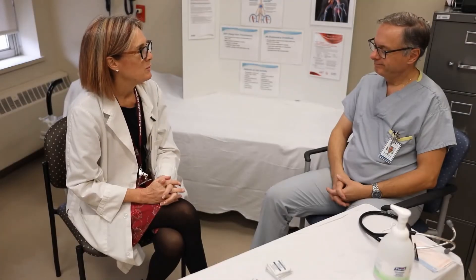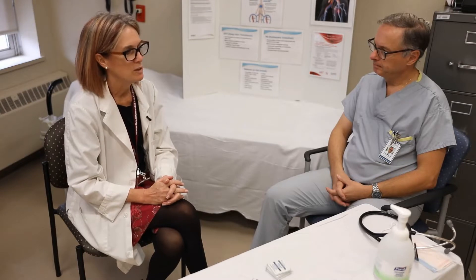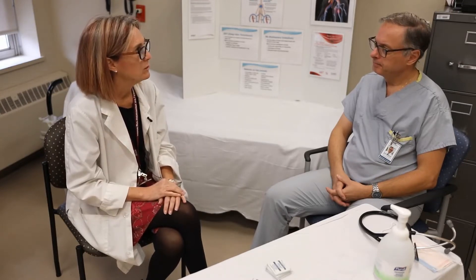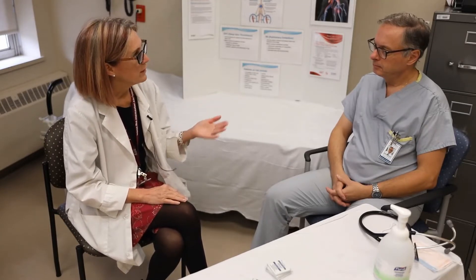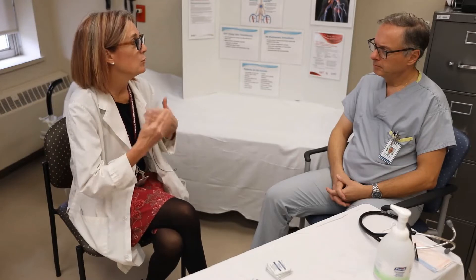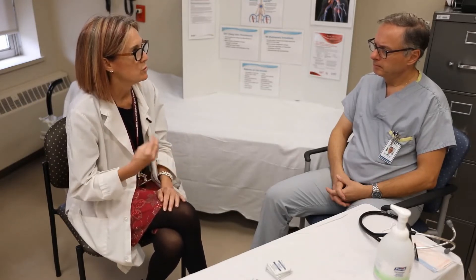Hi, Dr. Ducatiz. My name's Laurie. I'm one of the nurse practitioners with the thrombo team here at the hospital, and today we're going to learn about how to self-inject the low molecular weight heparins. I know that you've been diagnosed with a blood clot, so you need the injections to help treat that blood clot. We're going to teach you how to do it and work you through your first injection so that you can do it at home by yourself and feel assured that you're doing it correctly.